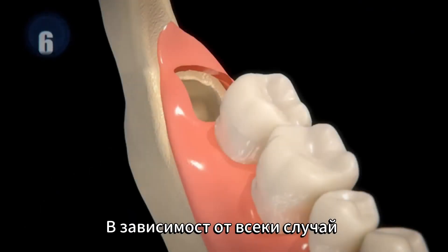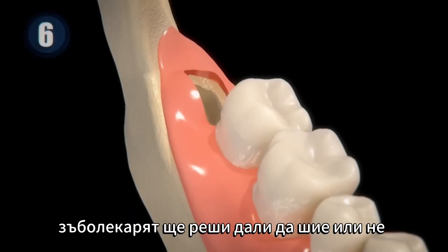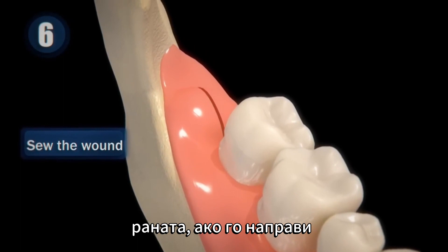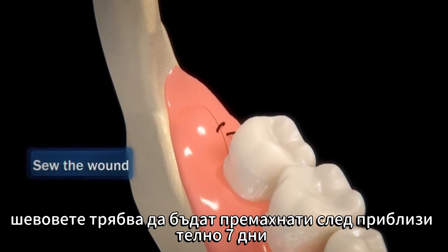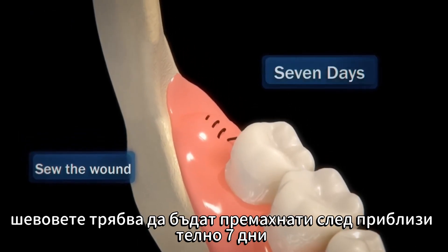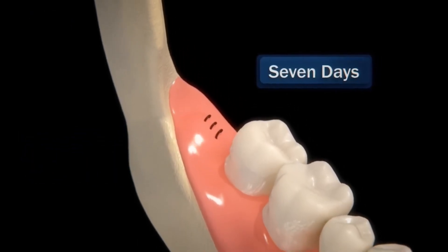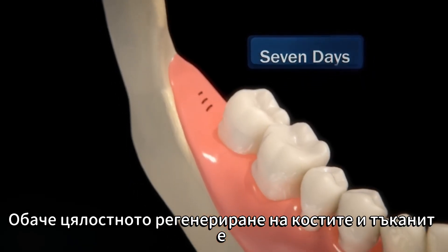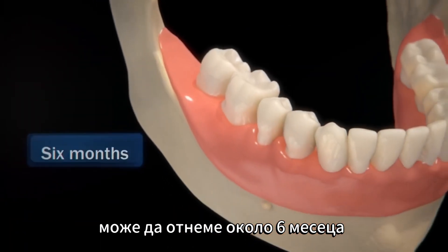According to each case, the dentist will decide whether or not to sew the wound. If they do, the stitches must be removed after approximately seven days. However, the total regeneration of the bone and tissue can take around six months.